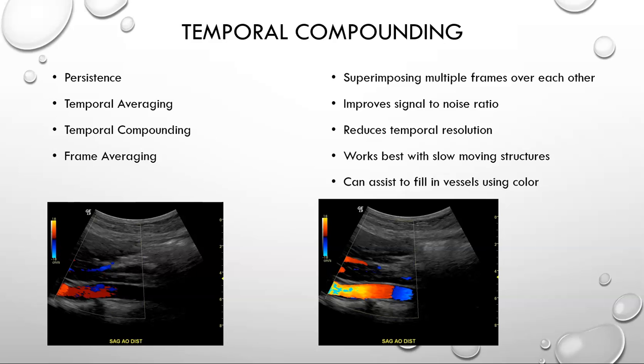Anyhow, temporal compounding reduces temporal resolution. Of course, it slows down your image acquisition, and it works best with slow-moving structures. It can also assist to fill in vessels using color.